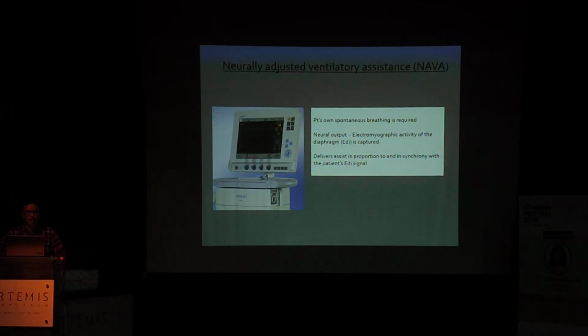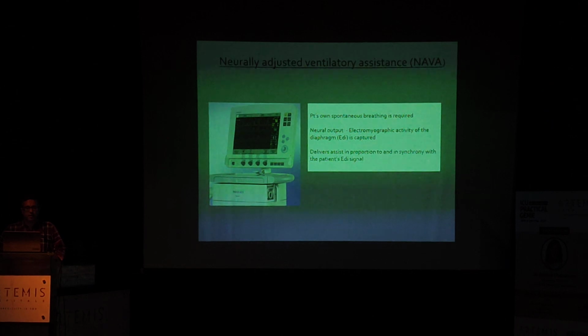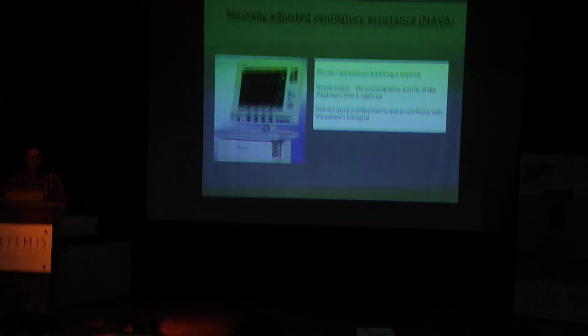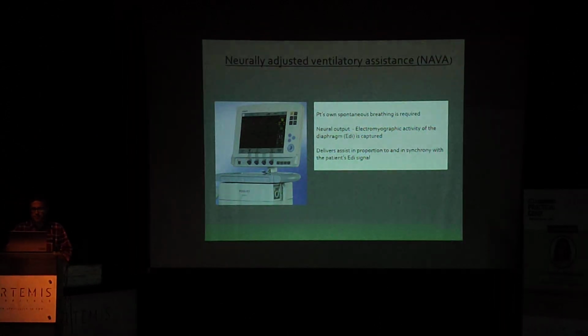So just a bit about NAVA. The patient's own spontaneous breathing is required. It measures the electrical activity of the diaphragm and delivers support in proportion and in synchrony with that signal.